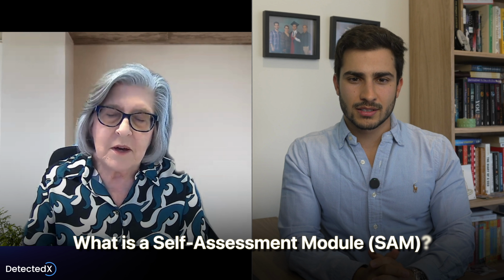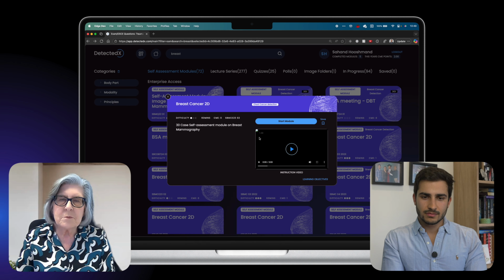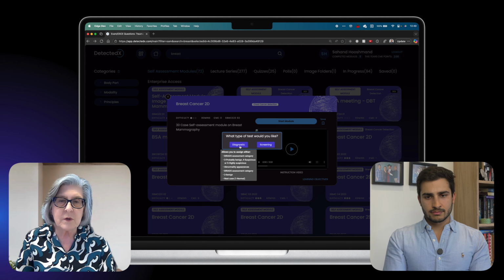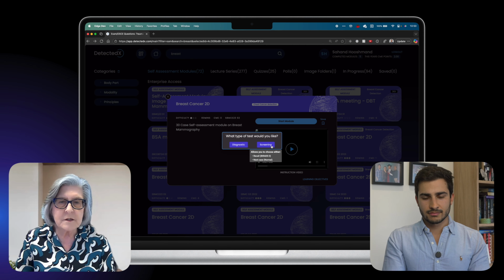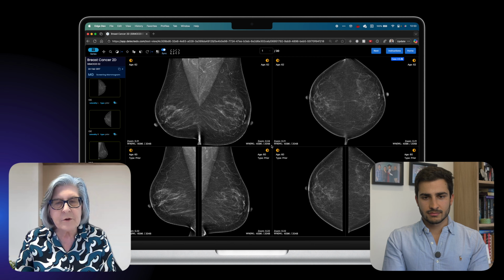And so you mentioned there are different modules essentially. So I know there are lecture modules that people can watch, and you also mentioned self-assessment modules and quizzes. What's the difference between those two? Well, in both cases, you're testing yourself out. But with a self-assessment module, it may be, for example, that we're using it for a screening module where there are a set of cases, maybe 30 or 60 cases, that are screening mammograms.